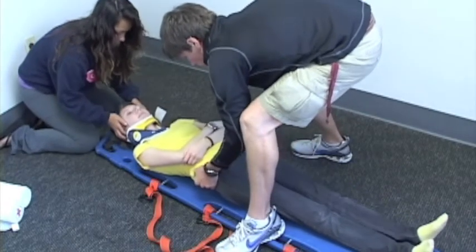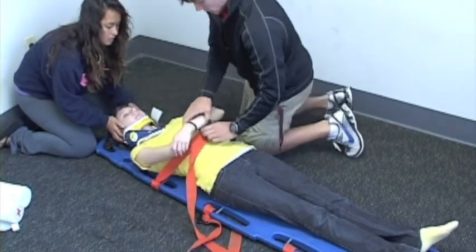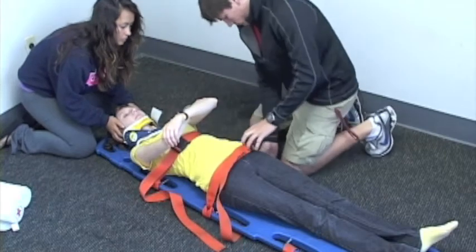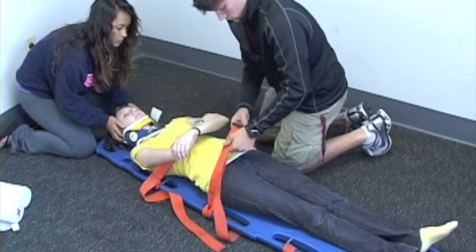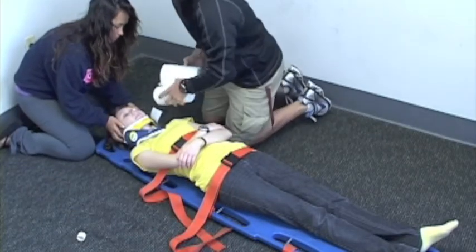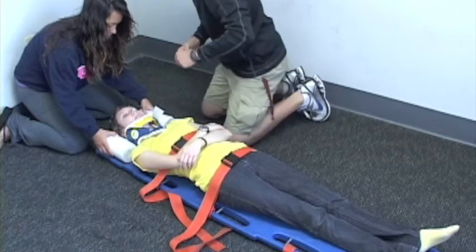One, two, up. My patient's secure on the board. As far as length goes, go ahead and attach her torso and abdomen straps. Just go ahead and hold your hands up there. We're going to have my partner butterfly her fingers out to place the head blocks. Can I secure my patient's head to the board?